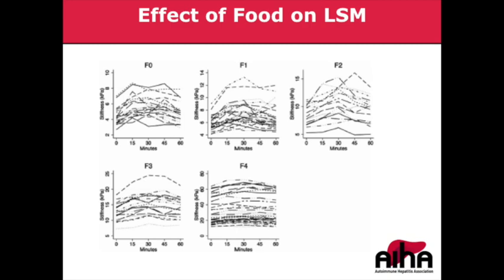But if a patient is coming to my clinic after a stop at fast food and upsizing whatever, is 2 hours fasting really enough? Maybe not. So we pushed it to 3 hours, but ideally, the longer the fasting, the more chance that postprandial blood flow may not affect the liver stiffness.